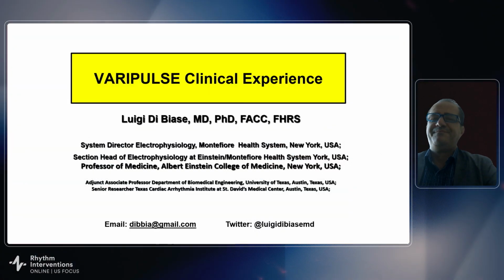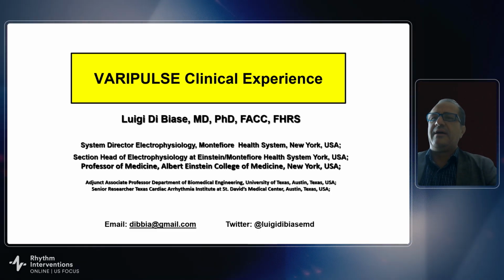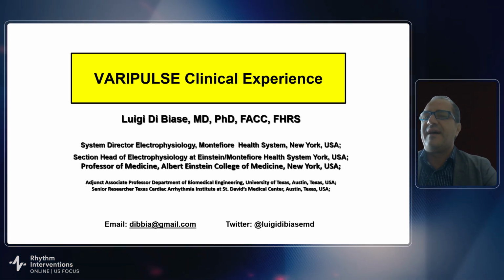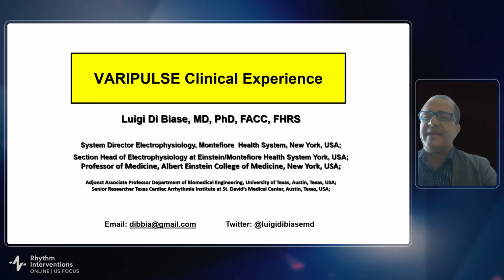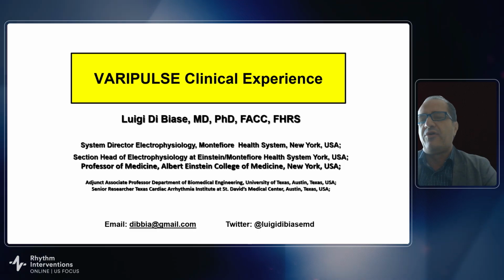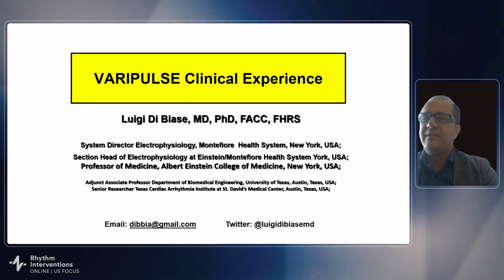Hello, Jason and everybody. So I will present a case of a PFA with the Varipulse catheter, and we will see what my workflow is and some important aspects of the utilization of this catheter beyond PVI.